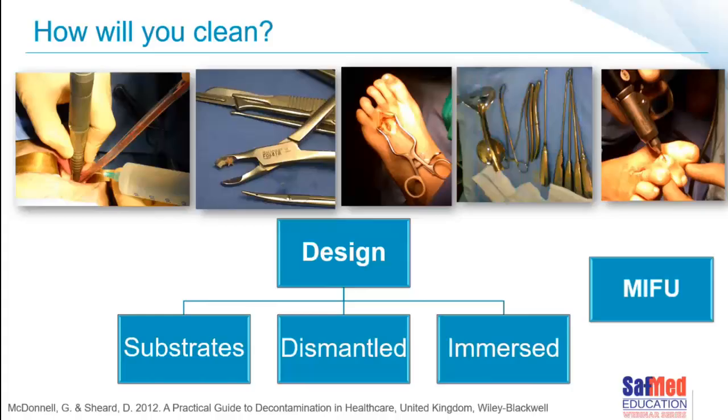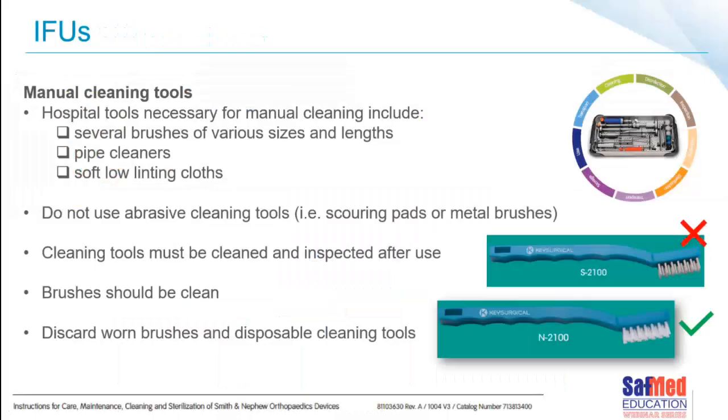Has it got hinges? What type of design is it? And what type of surface is it? Is the surface rough? Is it smooth? Is it a device that can be immersed into fluid or not? Is it something that I can only wipe off? All of these factors I need to take into account before I can actually clean it. And really importantly, what do the manufacturer's instructions for use say about this particular device? Without the manufacturer's instructions for use, I really do not have very good guidance. It's very important that I understand what the manufacturer's instructions for use are.